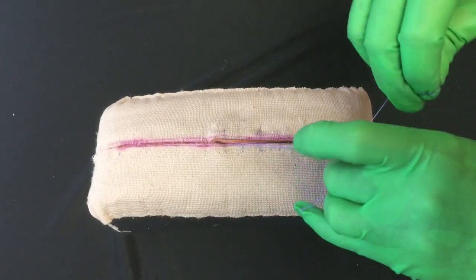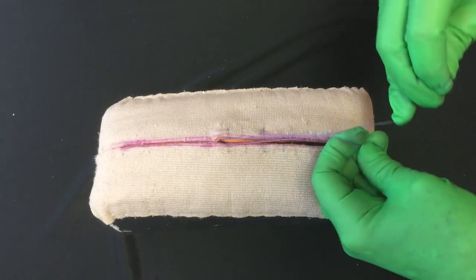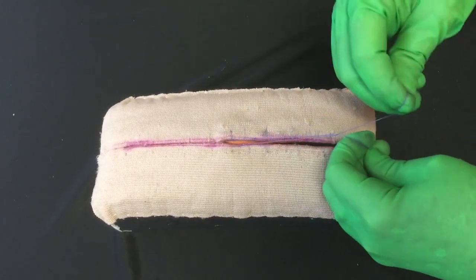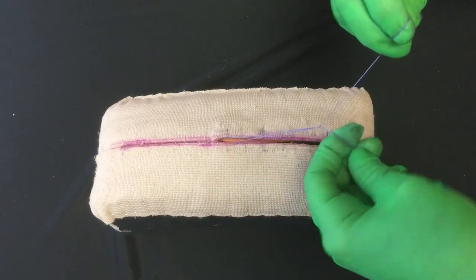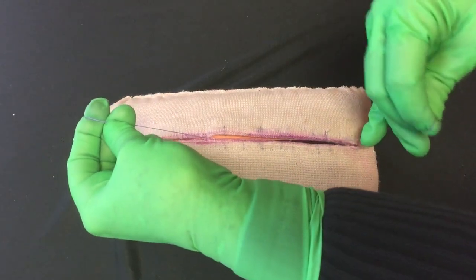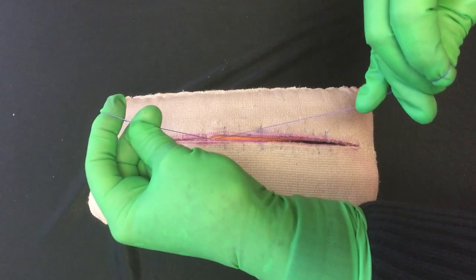So if you notice when I'm going to dive under here with my index finger, and if you notice when I pull it, it pulls the incision together. So you kind of want to pull parallel. Dive under with my index and over with my right hand, and then I'm going to pull. You're going to tie parallel with the incision because that's going to make it come closer together.